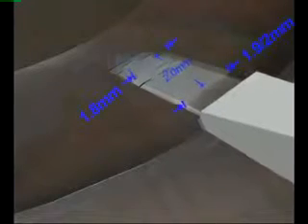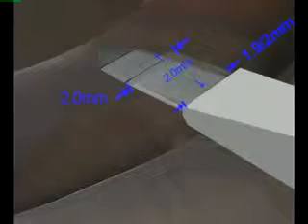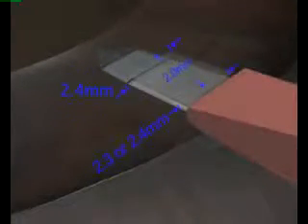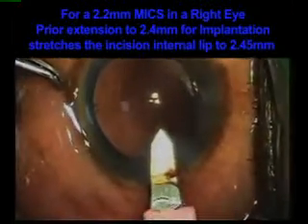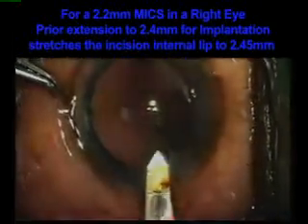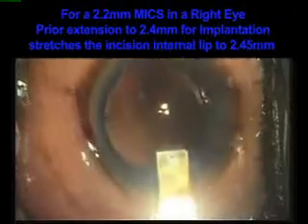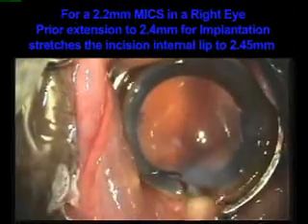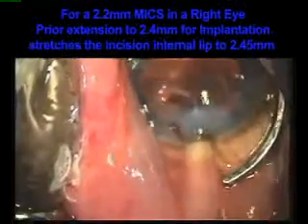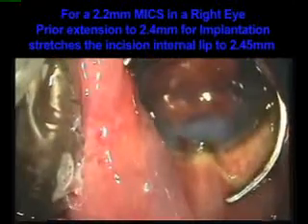All the right eyes of the two groups were implanted after prior extension of the microphaco incisions from 1.8 to 2 mm and 2.2 to 2.4 mm with the guarded advancement of the calibrated microblade up to the second level marking line. This facilitates easier engagement of the micro IOL cartridge tip with better grip and induces minimal stress to the incision.